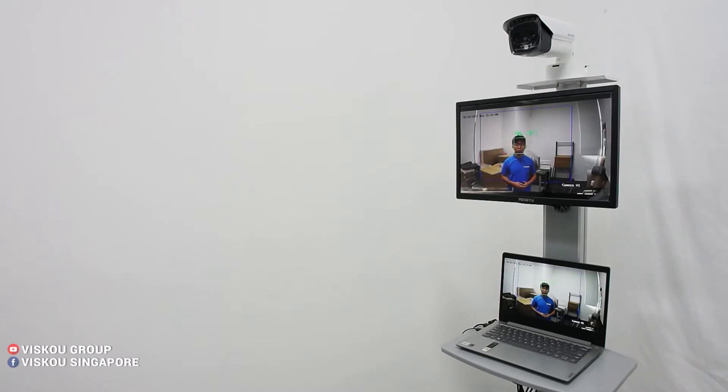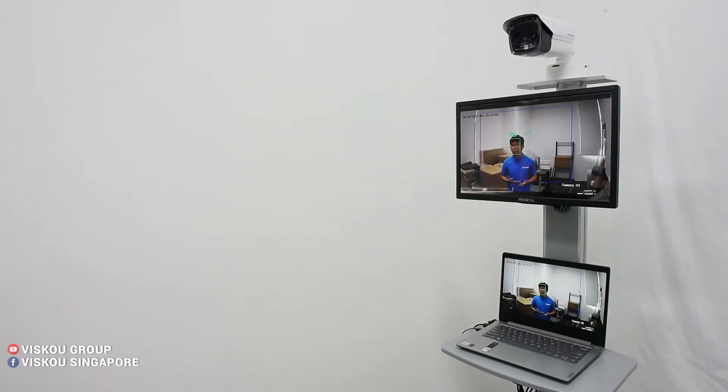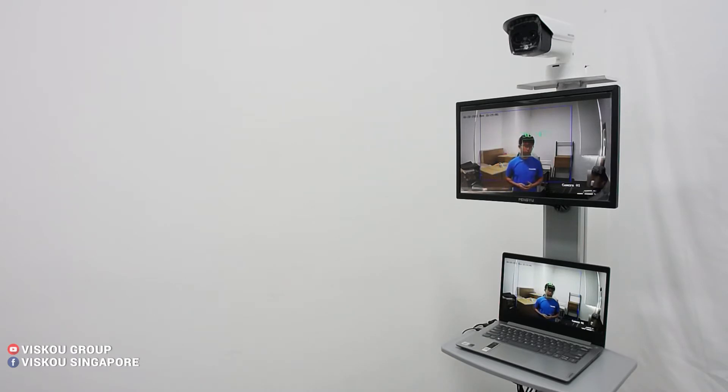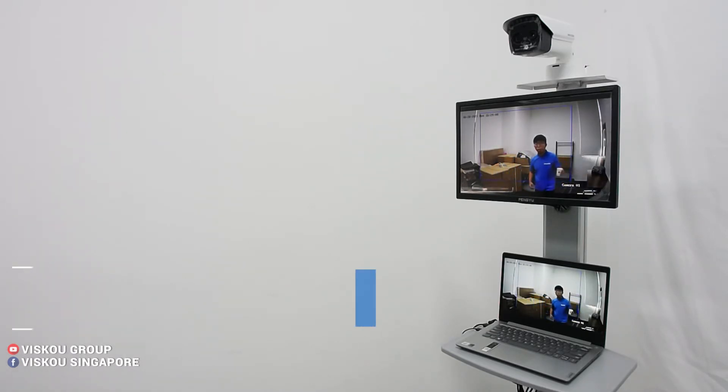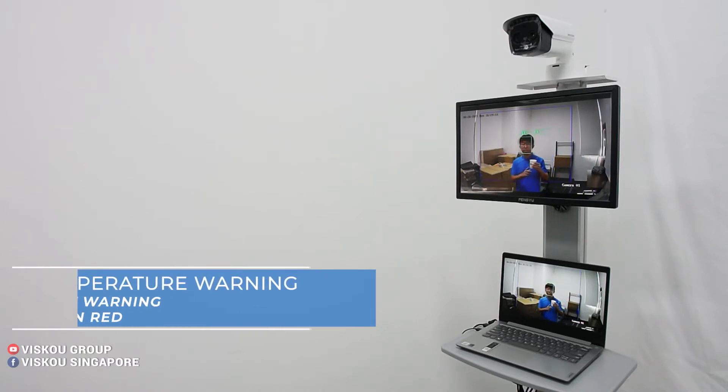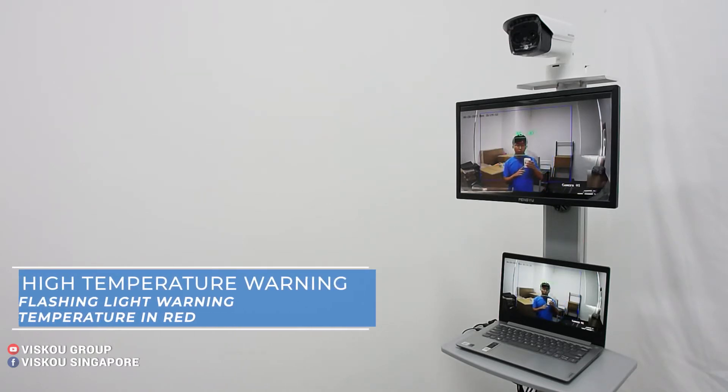So this camera also has an audible alarm and also flashing light when we have a high temperature. So I will demo to you guys. I bring along my hot water. So now I put it on my forehead.